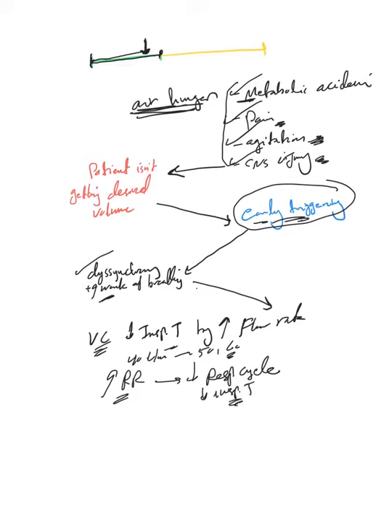But the easier solution, I think, is to switch to pressure control mode, because here the patient will have more liberty to pull his tidal volume.